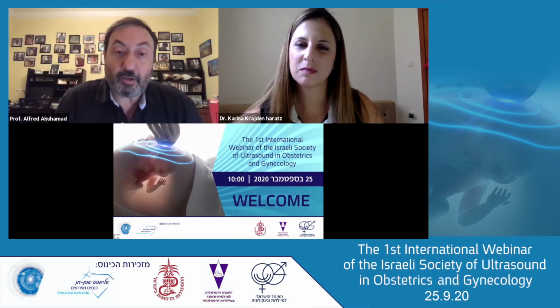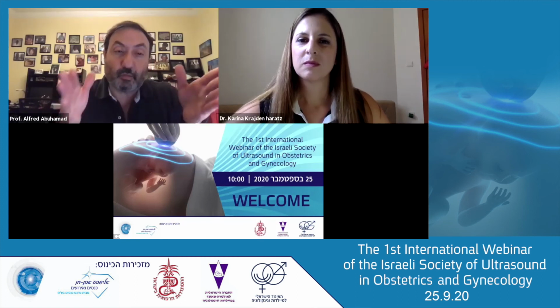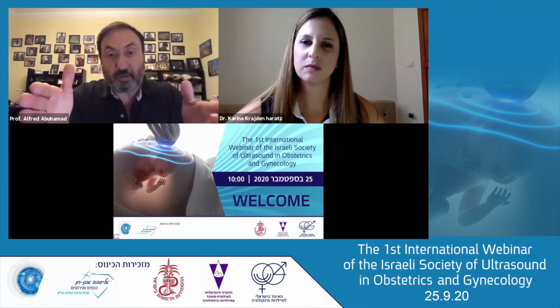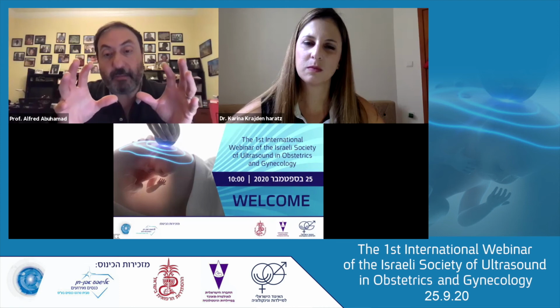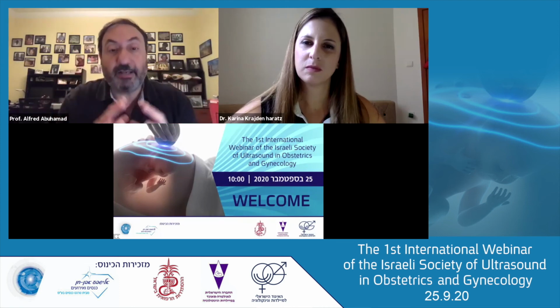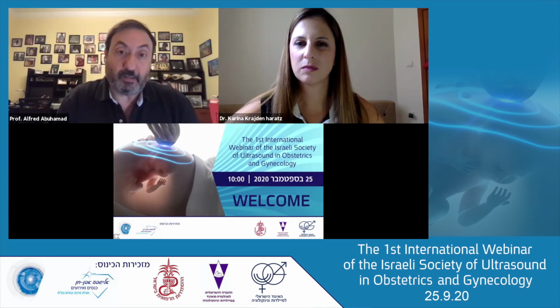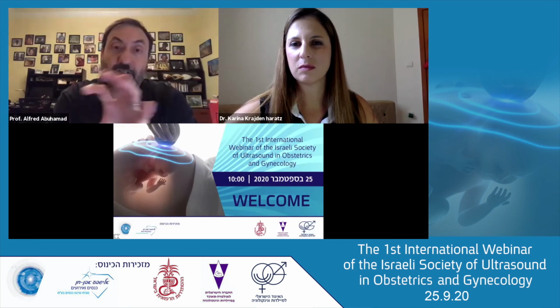But this document goes into details of what to look for in the first trimester, and it's focused between 12 and 13.9 or 14 weeks. So this seems to be the gestational age window where the first trimester ultrasound is recommended now. And most studies in the literature have been done in this gestational age window.